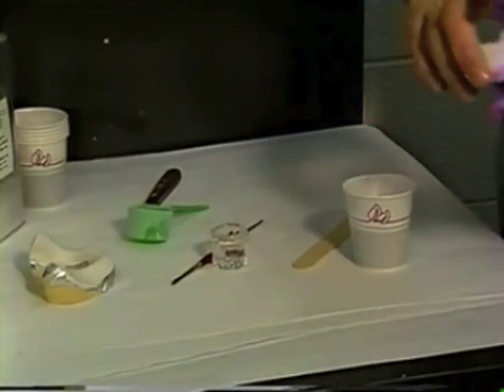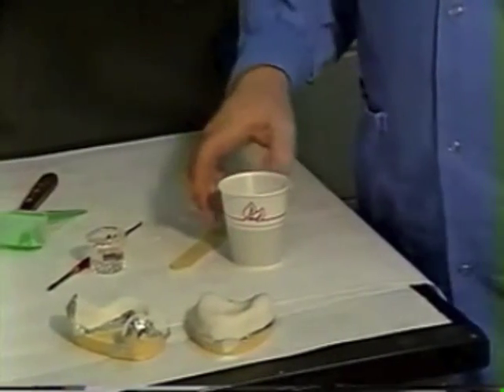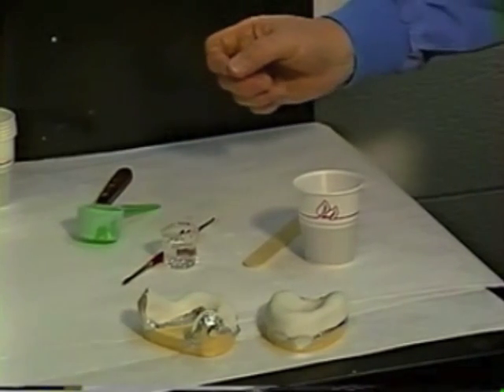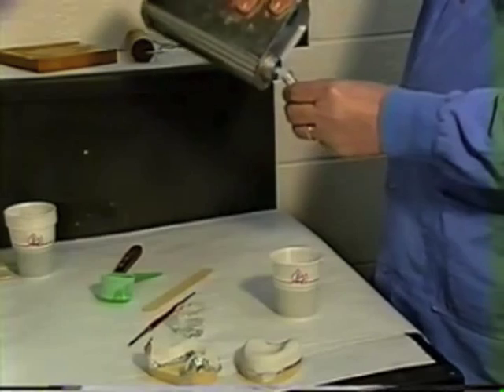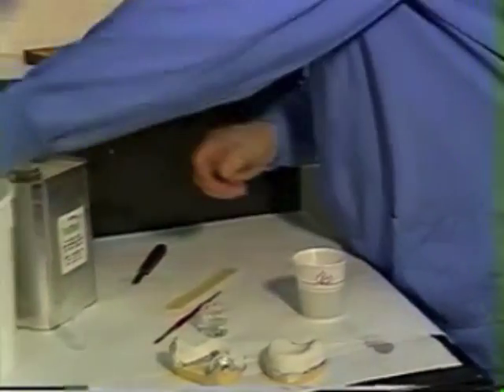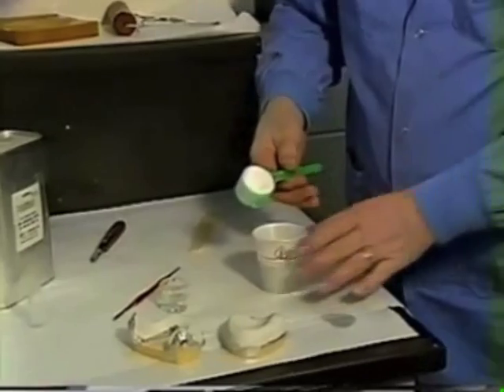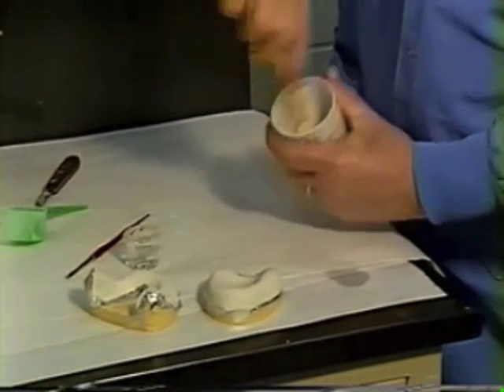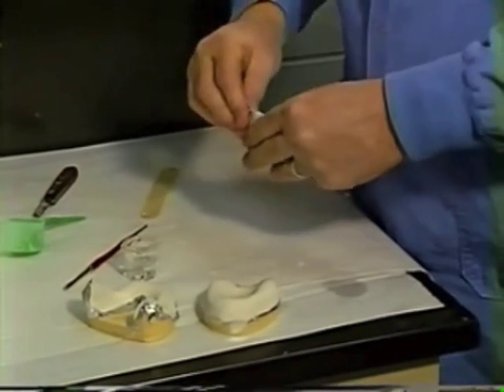Now, in making handles for our trays, I usually do both at the same time out of one mix — I find that easier than using scrap material from adapting the tray itself. Measure a full measure of monomer and somewhat less than a full measure of polymer, dump the polymer into the monomer, get it thoroughly wet, and once it's totally mixed with no dry spots, pinch off the top and let it sit.